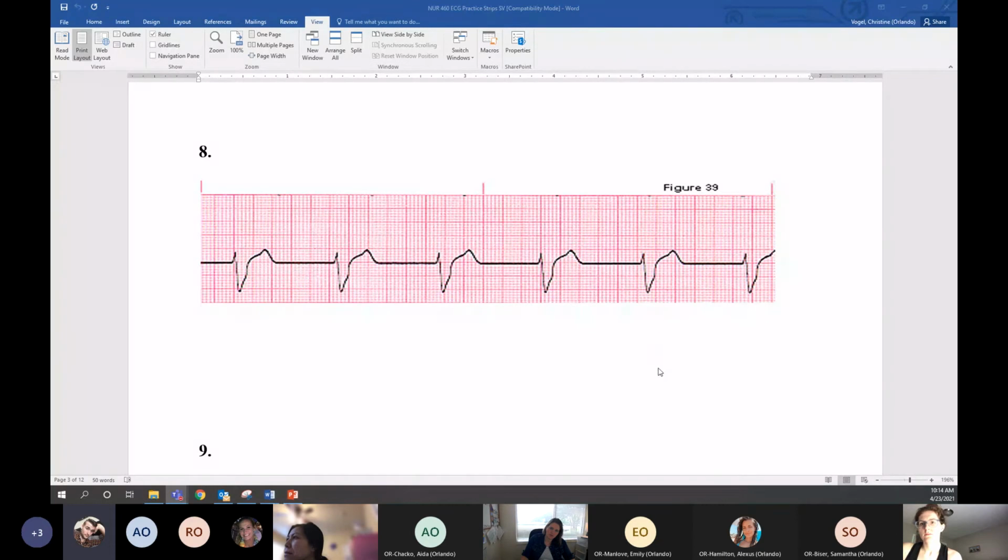Is it the idioventricular rhythm? It is. Okay, this is a tricky one. Who said that one? Logan. Logan, awesome. It actually is. It's an accelerated idioventricular rhythm. So this is just originating in the Purkinje fibers, but it's still a little bit accelerated. We know it's not sinus or a junctional rhythm because it has no P wave, but the QRS, there's something wrong with the ventricles. This is wide. So that is IVR.